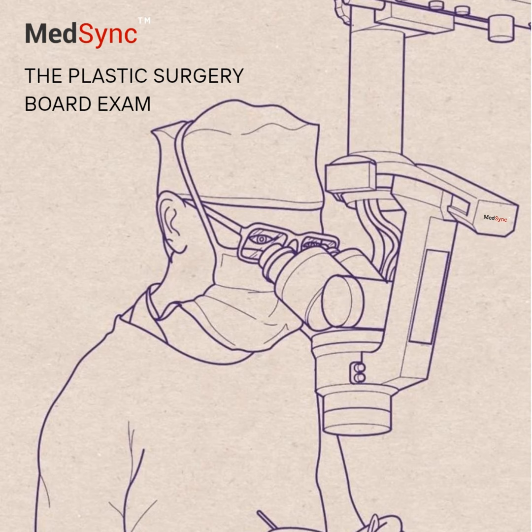But a point of caution. Be careful using them in patients with rheumatoid arthritis who are on systemic gold therapy. Interesting point. Is there a rule of thumb for pulse duration relative to TRT? A useful tip is that the ideal pulse time is often around half the TRT of the target structure.